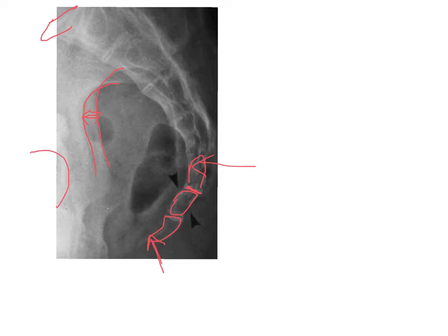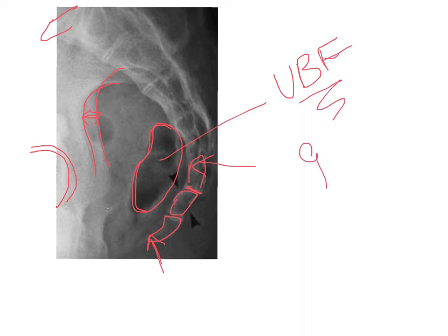we may have gotten a good look at the femoral head sitting within the acetabulum, and that is another good indicator of rotation or lack thereof. You're seeing this blackened area here. This is not pathology. It is not really anatomy. It is what we call a UBF, an unborn fart, fellows and friends, or simply gas in the intestines. Okay?